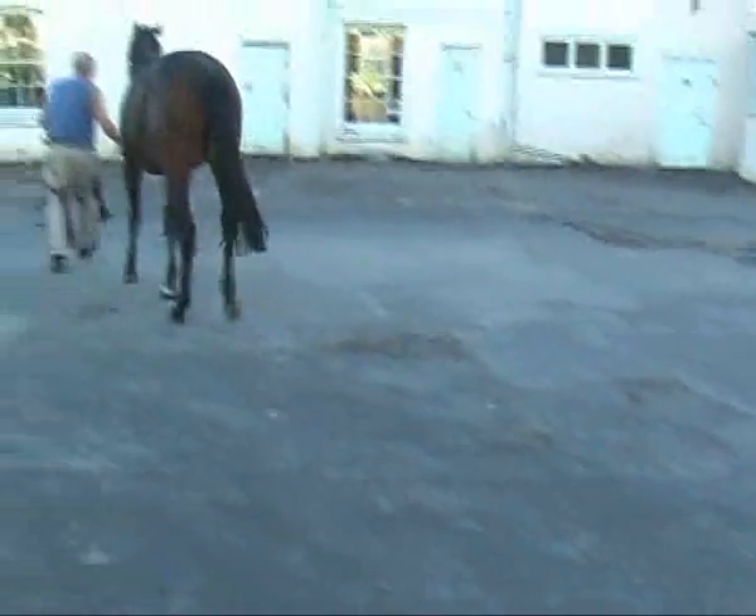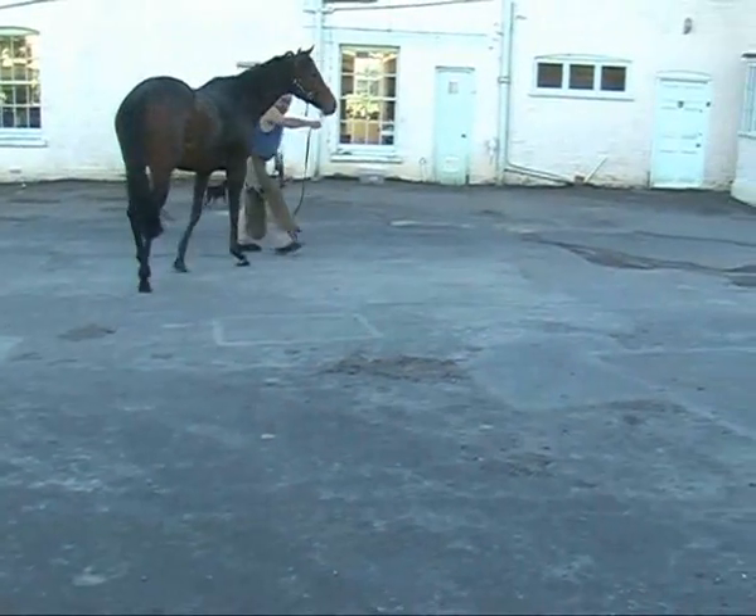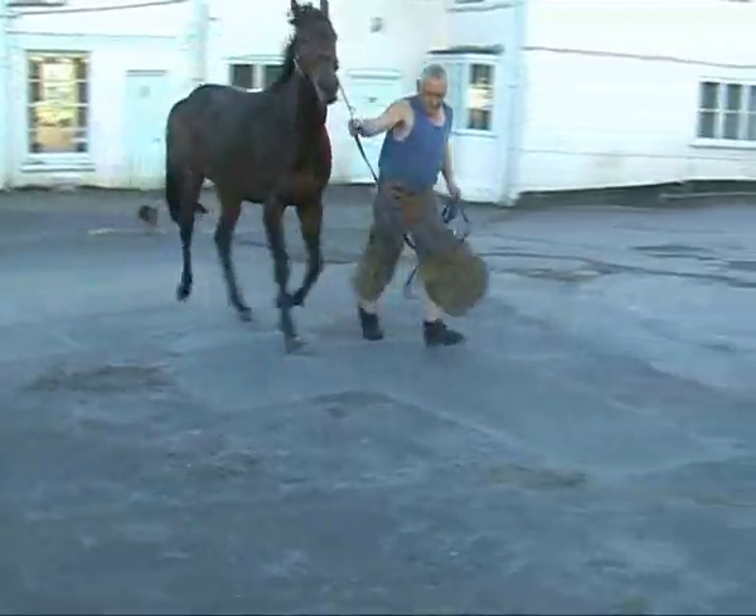Well, barely over an hour ago this was a horse that was very careful about coming down the yard. She's now perhaps not quite ready to trot, but much more up on her toes and much freer moving altogether.